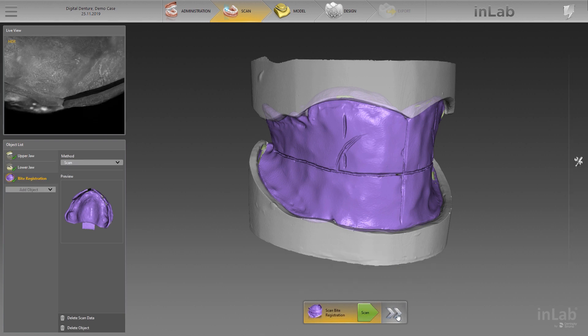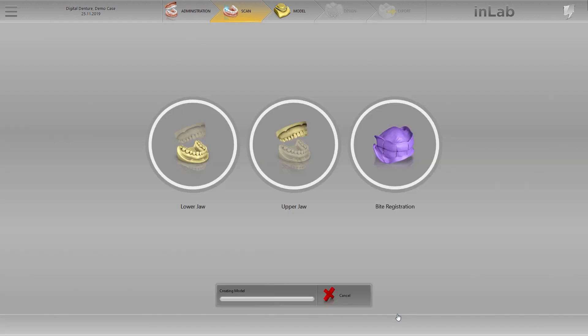Switch now to the model phase and start the preparations for the denture design.